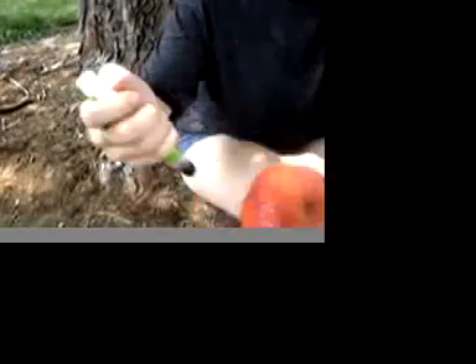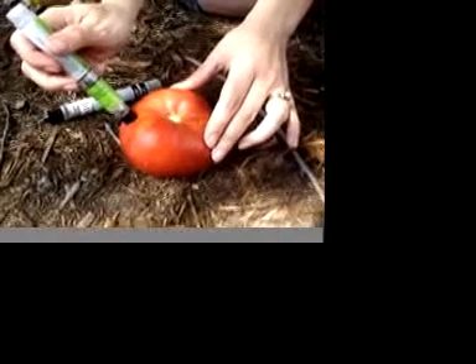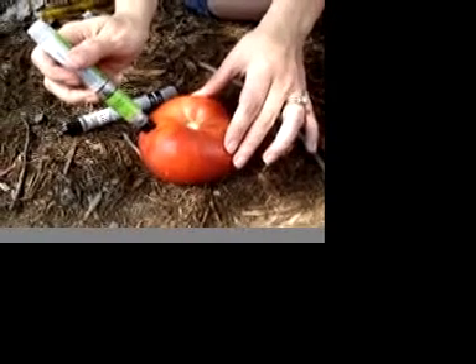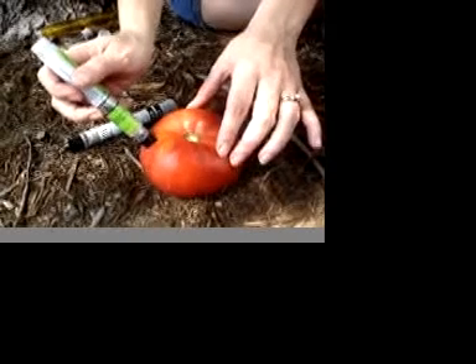Now I'm going to try to do this to the tomato. Let's put it right down here so you can see — that was a loud click. And I held it on there to about the count of 10 mentally.